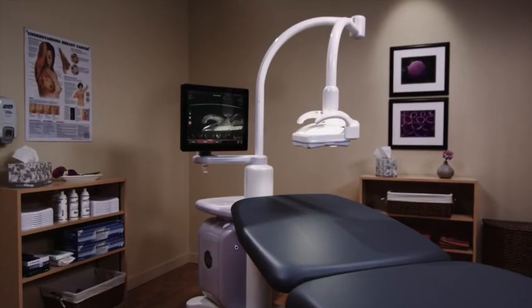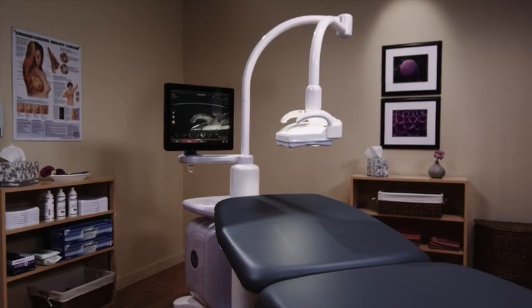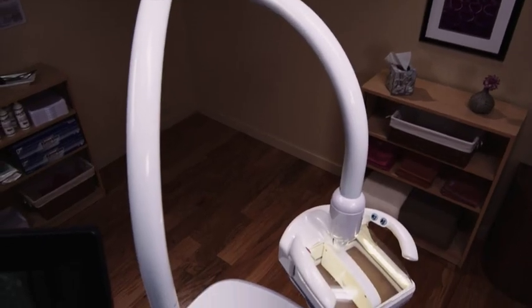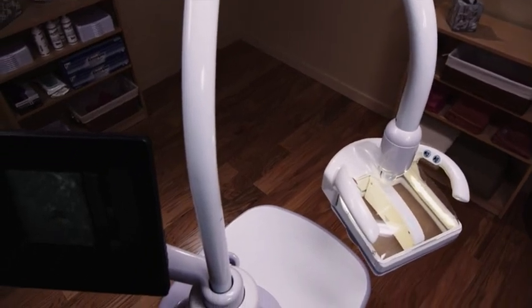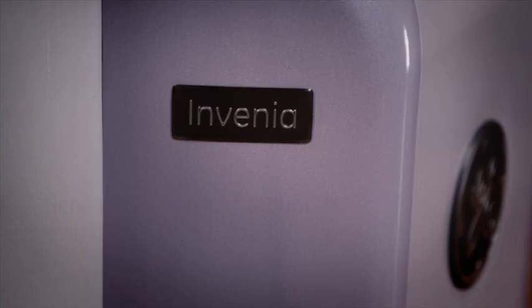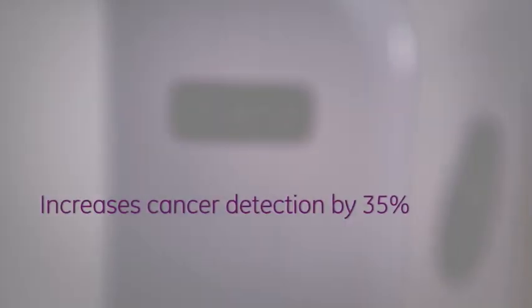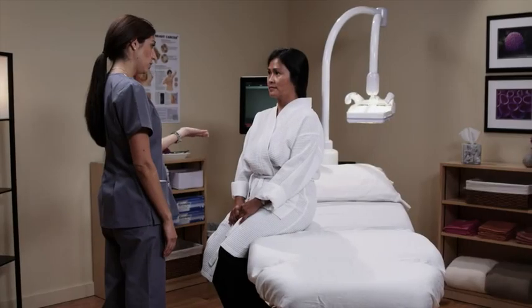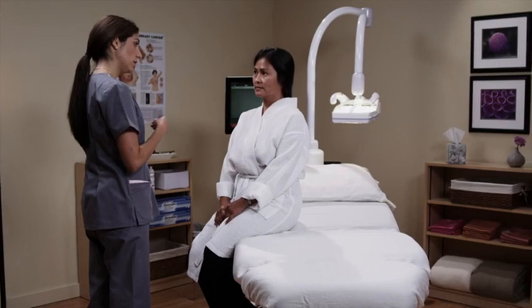The Invenia ABUS automated breast ultrasound system enables physicians to look differently at dense breast tissue. This system comfortably and quickly images women with dense breasts. Studies have shown Invenia ABUS increases the ability to detect cancer when performed after a mammogram. This video demonstrates what you can expect if you have an Invenia ABUS breast exam.